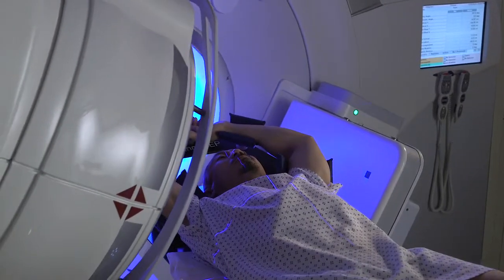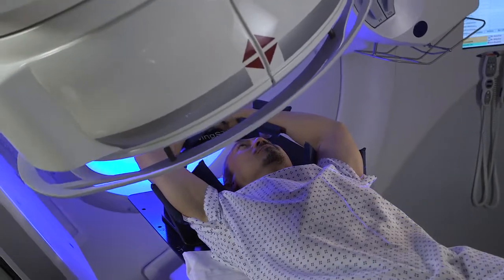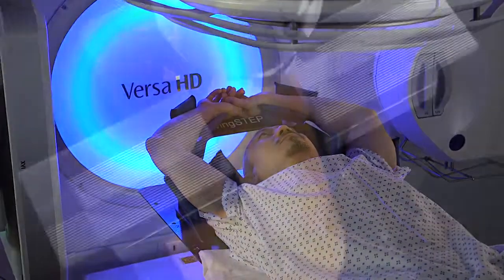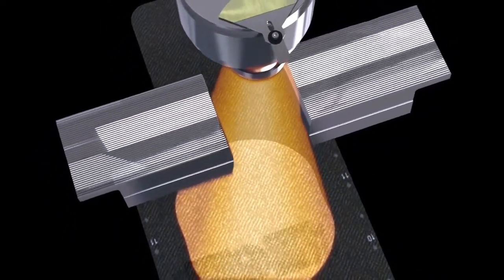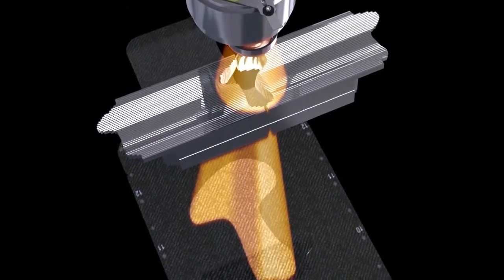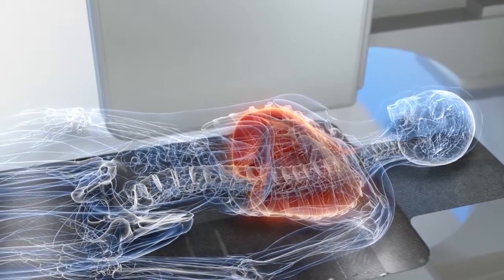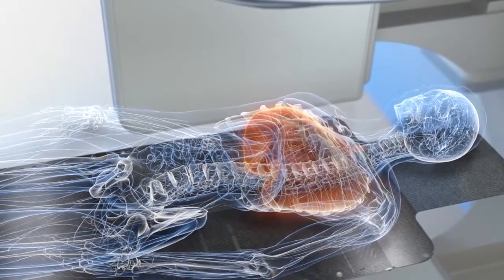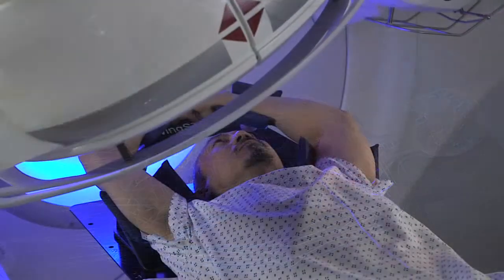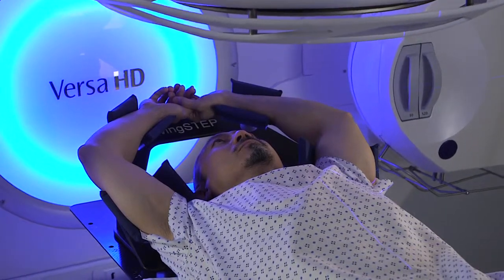As treatment begins, you may hear some clicking and humming sounds or sense some movement, but the machine doesn't touch you, and the radiation is invisible and painless. Our linear accelerators allow the beams of radiation to be shaped to conform to the size, shape, and volume of your tumor. This allows exceptional precision for the greatest effectiveness while avoiding healthy surrounding tissues in order to reduce the risk of side effects. Built-in safeguards and system checks support your safety during treatment.